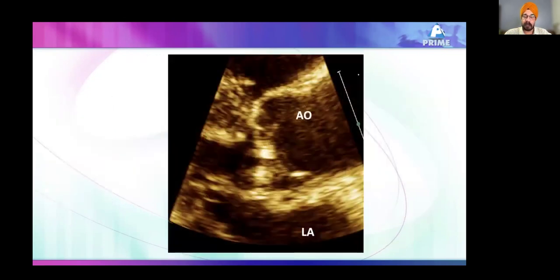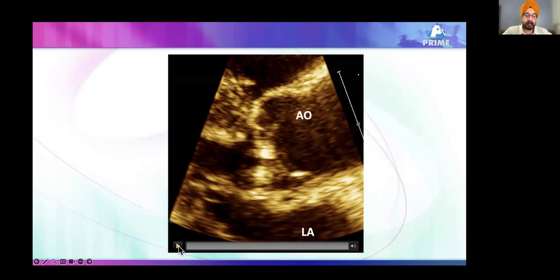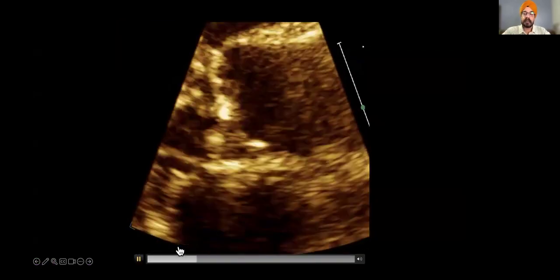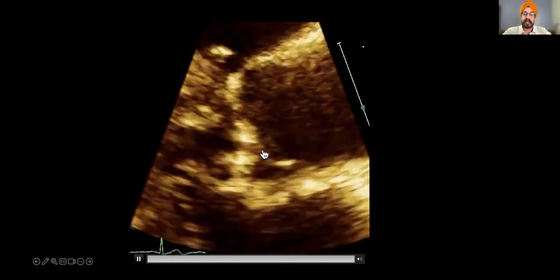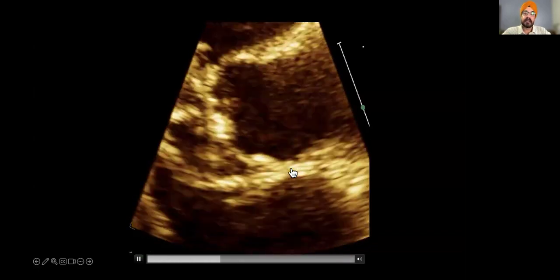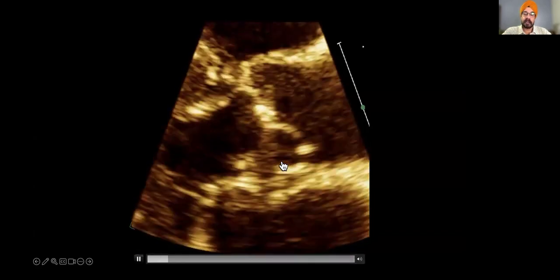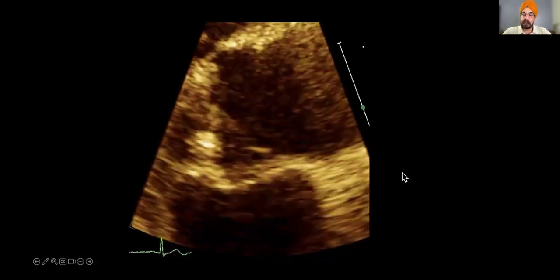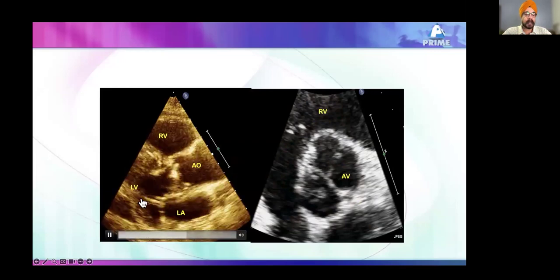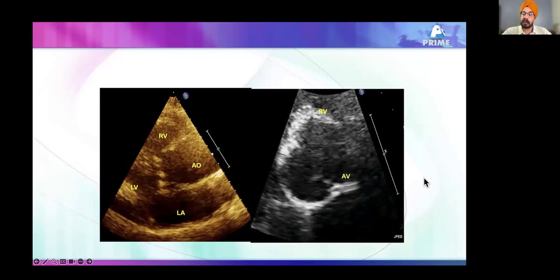Before I jump to the supravalvular aortic stenosis, out of curiosity, I'm showing you something which surprised me once I was imaging. Do you see some aortic valve, and on the aortic valve you see some chordy kind of stuff attaching to the aortic valve? Yes, this was a patient with a bicuspid aortic valve, aortic stenosis, and you see these filamentous structures which were attached on the aorta. Again the same thing, and this was actually a bicuspid aortic valve.